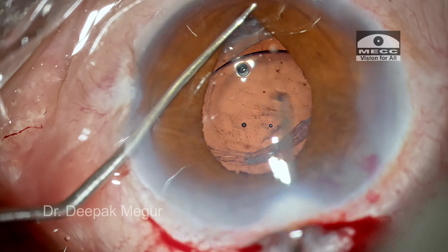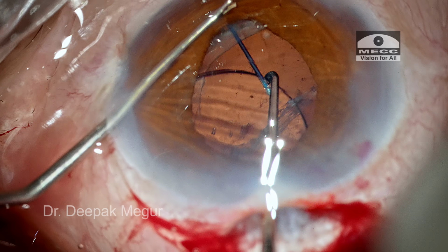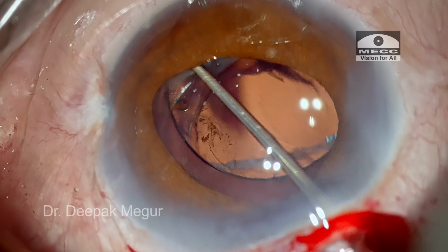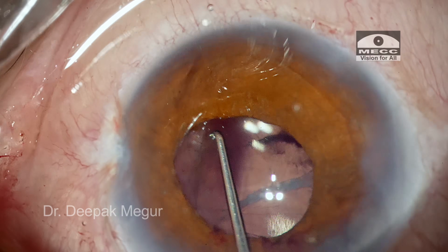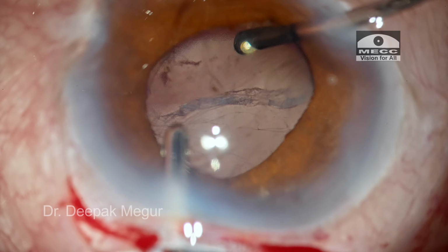I'm ensuring that I'm able to see the impressions of the haptic under the iris. I'm just trying to lift it up because I want to be dead sure that the haptic is just below the iris and not inside the vitreous cavity. During this process, there is some amount of bleed which is happening and it has gone into the vitreous cavity. Again, I need to deal with it. So I had to remove the OVD as well.